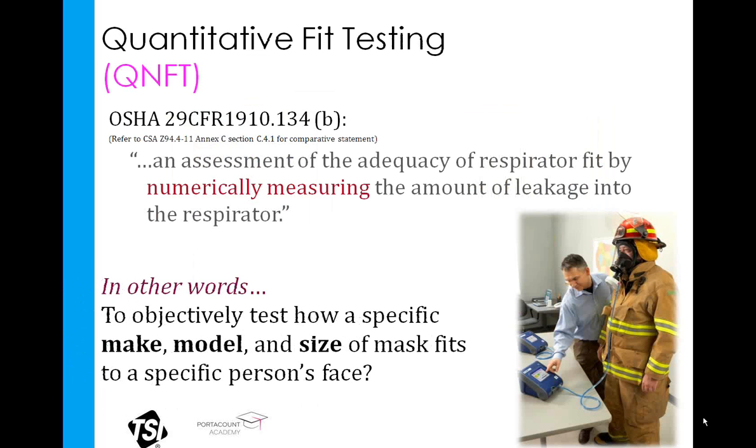Quantitative fit testing is a method of taking a measurement aside from the person's response to determine if the mask fits or not. So we're measuring how well a specific make, model, and size of respirator fits to a specific person's face. And the key there is that it's a measurement. So it's an objective test, and therefore it is considered to be obviously a bit of a superior method.